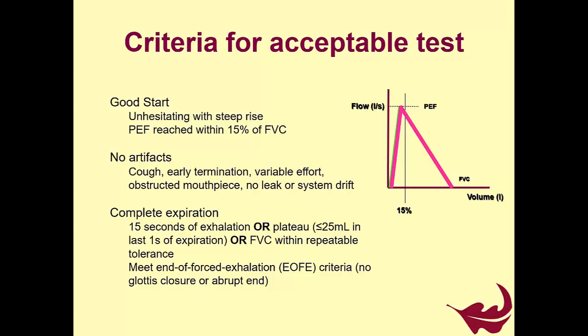In other words, I can't exhale for 15 seconds. I can only do it for 5 seconds, 6 seconds, 7 seconds, etc. But then it must be repeatable all the time. Otherwise, the machine should only cut off at 15 seconds, which is quite long. But you would know when you see very ill patients, not the type that we would see in diving, but people with severe obstructive lung disease, they can exhale for 2 days, they just carry on and on and on. So 15 seconds is the limit there.